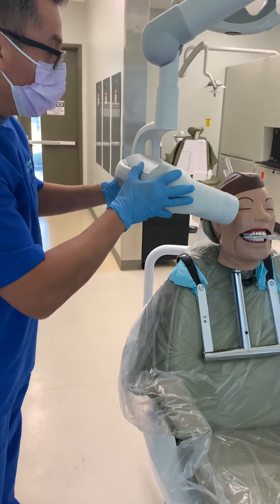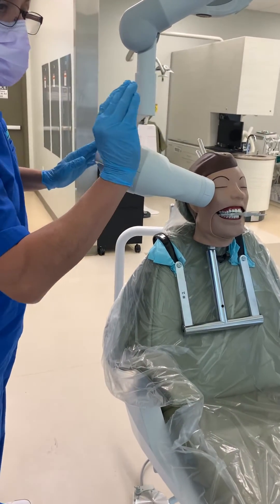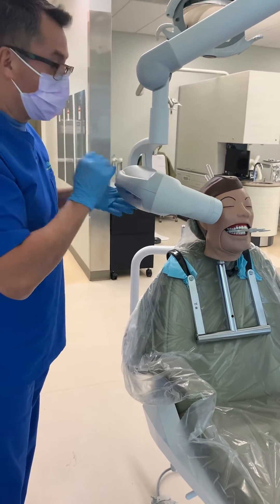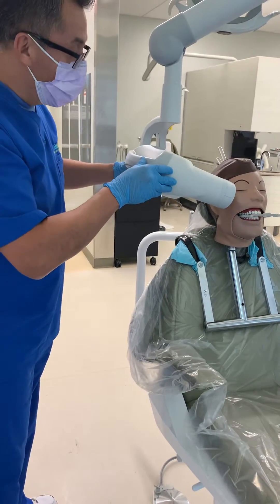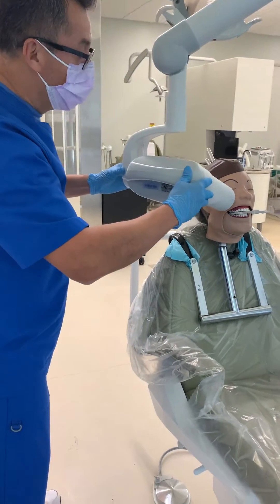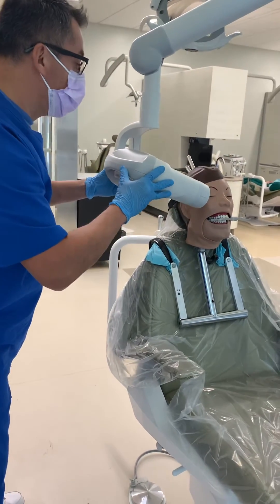Step number one: you don't want to hold the X-ray straight against the teeth like that because our teeth curve. If you do this, you're going to get overlapping. So you have to do a small adjustment with what's called a horizontal angulation — that means you're going to tilt the PID slightly. Too much of this will cause overlapping, and not enough will cause overlapping as well. So we're going to tilt a little bit.